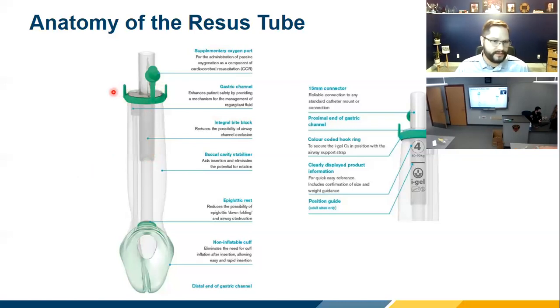Further down the tube you'll see hooks where you attach the neck strap. Then from about here to here, there's an integrated bite block. That bite block is designed so that if the patient becomes conscious, seizes, or starts to clench down, they're not going to cut through the tube and lose the airway.